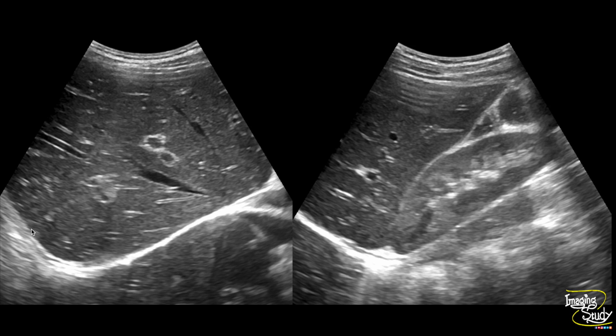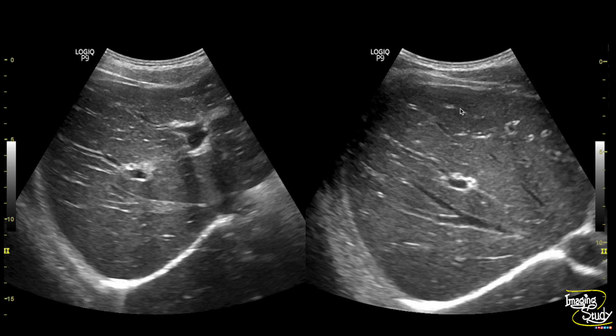Here you can see the liver looks quite normal, but comparing the liver echogenicity with the adjacent kidney, there is decreased echogenicity of the liver or increased echogenicity of the renal parenchyma. To differentiate liver from renal disease, note that the patient had jaundice. You can also see many portal venous walls are visualized, which is not commonly seen — this increased portal venous wall reflection indicates periportal cuffing, also called periportal prominent echoes or starry sky appearance.